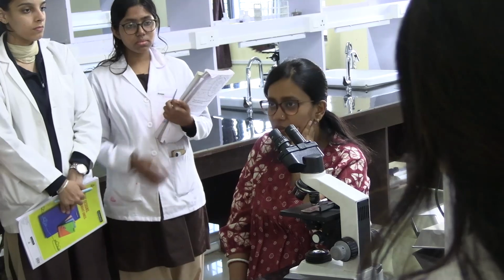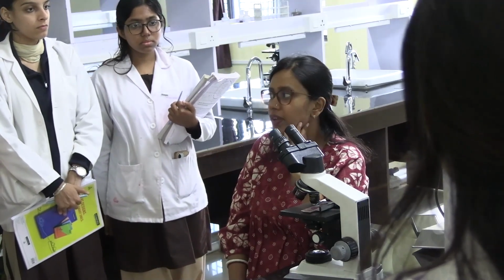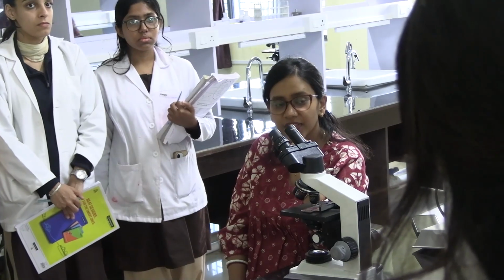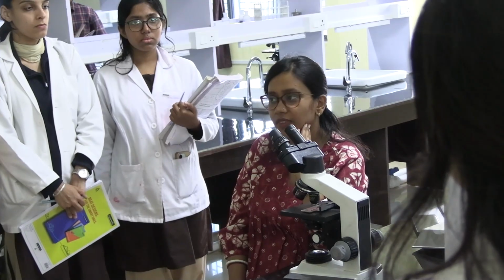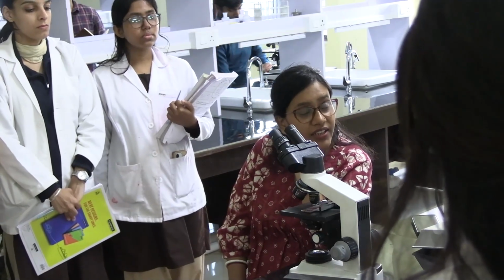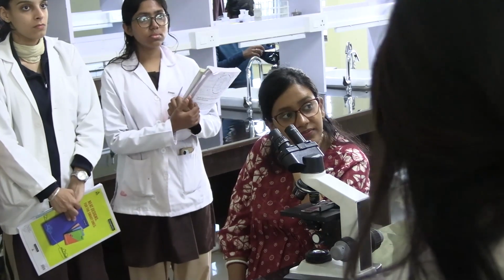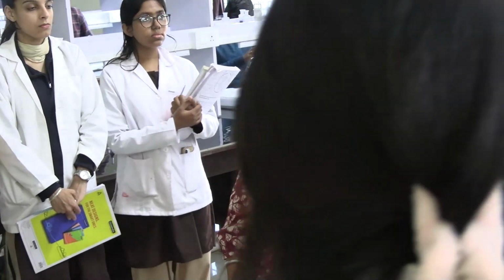Okay. Now when I say adenocarcinoma, what do you understand? It's a malignant lesion which is arising from, with what kind of epithelium? Squamous epithelium. Then where does squamous cell carcinoma arise from? Okay, next, anybody else with a better answer? Endothelium proliferation. Where do you get endothelium? Lining of blood vessels. So you're telling me that adenocarcinomas are lesions affecting the blood vessels.